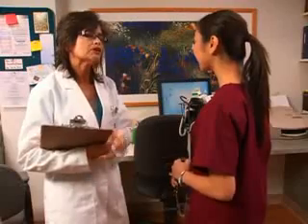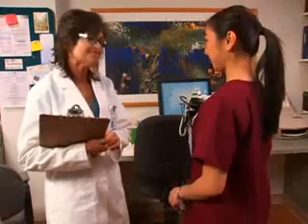It sometimes takes me a bit to find the brachial artery, but I get it. And what do you assess for? I don't want to use the arm with an intravenous infusion or a cast. Or the side where there's been breast or axilla surgery. You should also not use the extremity with an arteriovenous shunt or an injured or diseased limb. Oh, now I remember that. We talked about it in class. Very good, Rose. Sounds like you have every reason to be confident taking these vital signs. Ready? Let's do it. Okay.